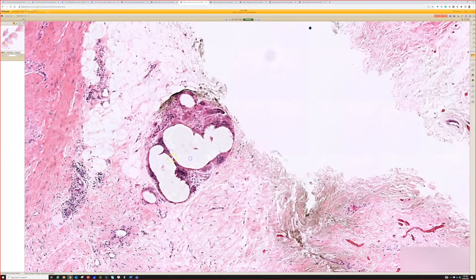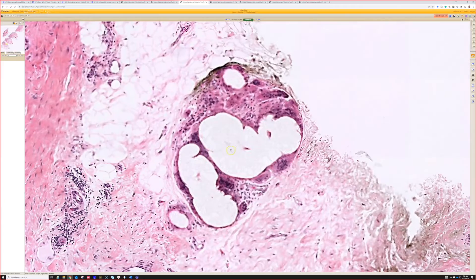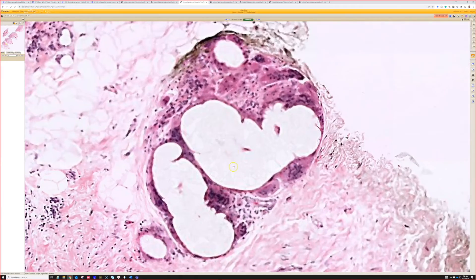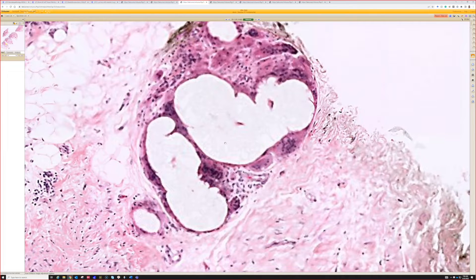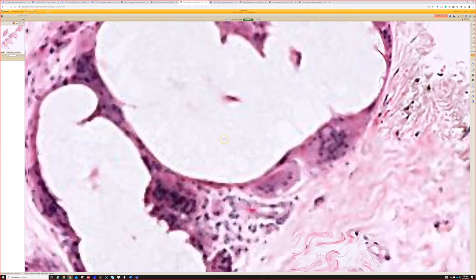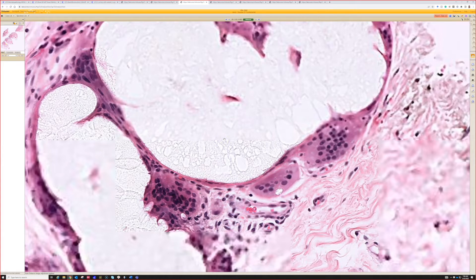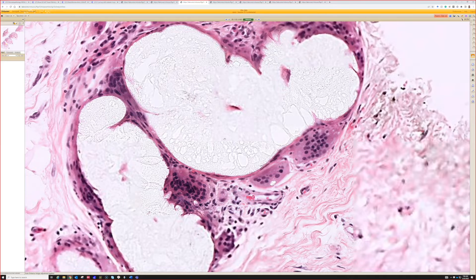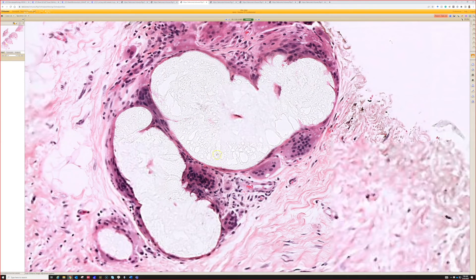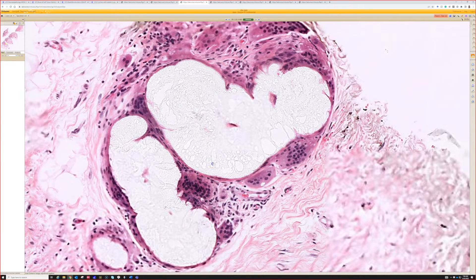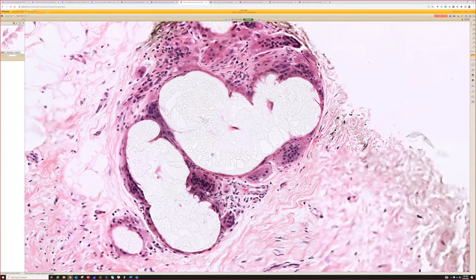We also have a little tiny focus of something else here — let's give it a second to focus up. There's a little incidental finding. Does anyone know what's going on here?